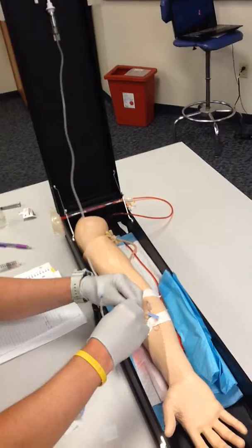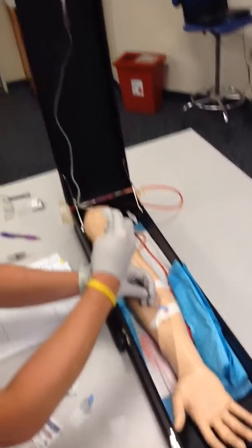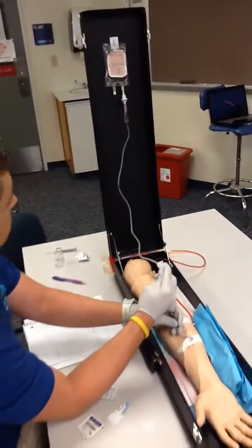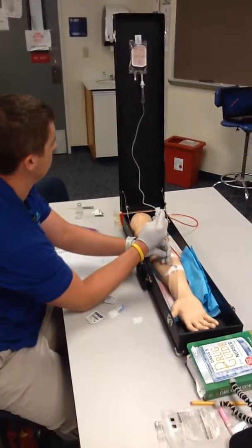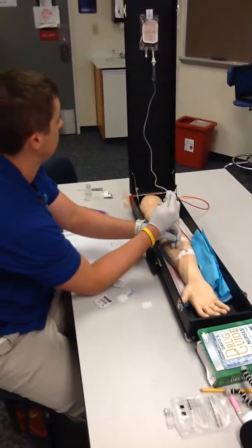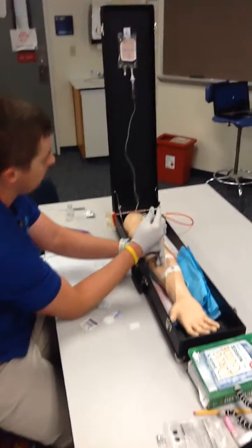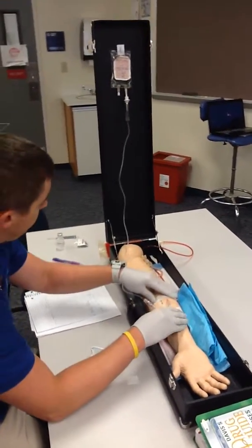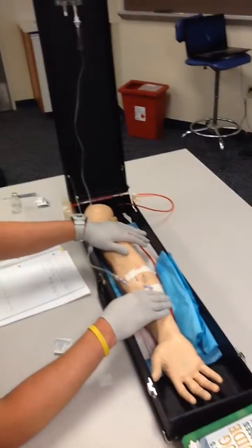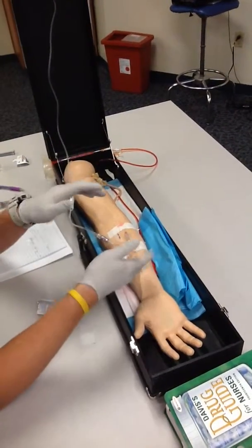Cap is removed. Inserted. Now I'll open up the roller clamp until I get an appropriate drop rate of the 4 drops per minute we were heading for. Is there any pain? Feel anything different right now? No? Alright, well this is going to run for 2 hours, so I'll be back just under 2 hours to check on you. So I will return your personal belongings.